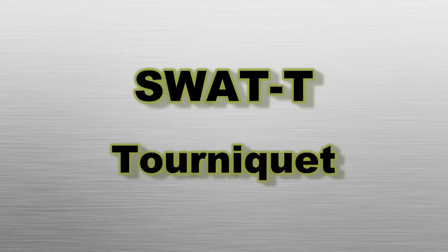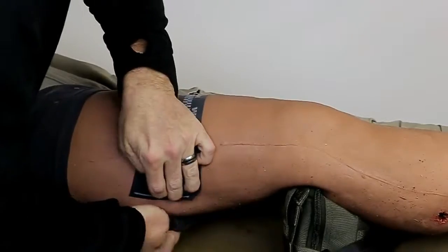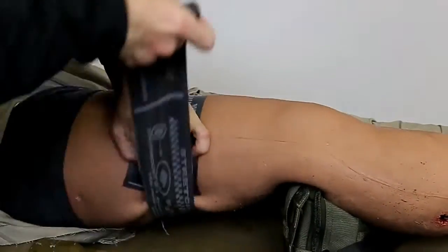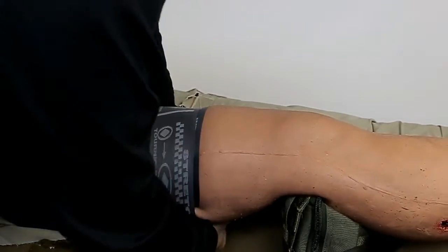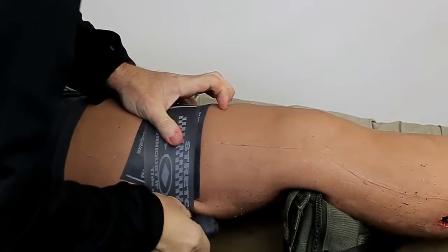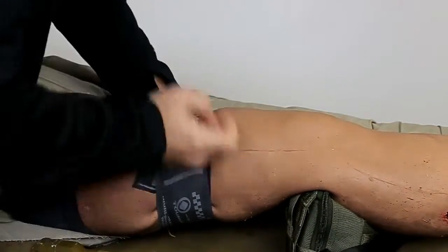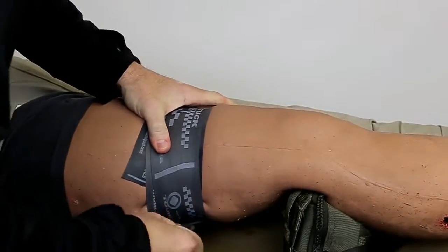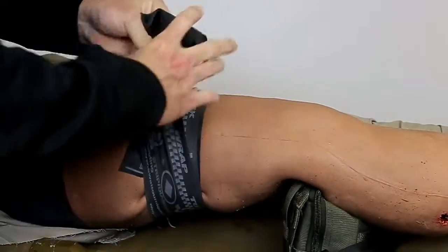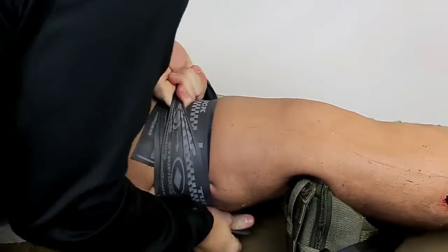Tourniquet. When used as a tourniquet, the SWAT-T should be applied between the wound and the body tightly enough to stop all blood flow to the limb. Be sure to overlap the first wrap of the tourniquet to secure it in place. Subsequent wraps should be tight enough to stop blood flow as shown on the pressure indicator markings. On the final wrap, remember to place your fingers underneath the SWAT-T to provide a place to tuck the tail of the tourniquet in order to secure it in place.